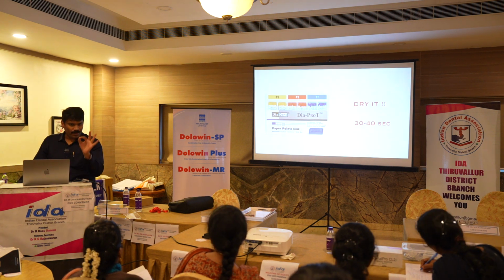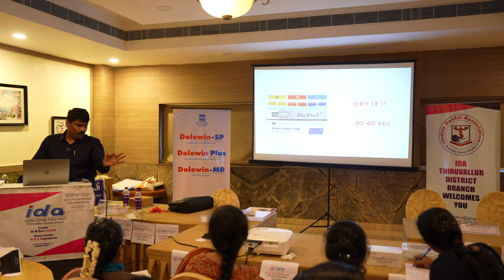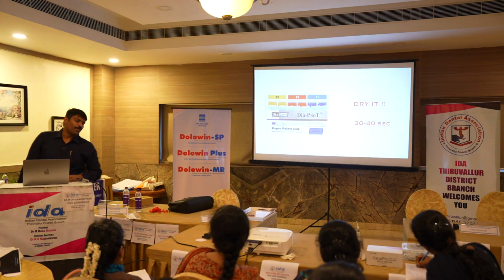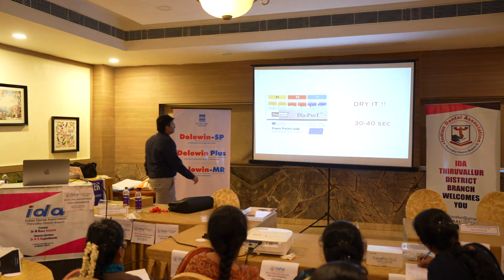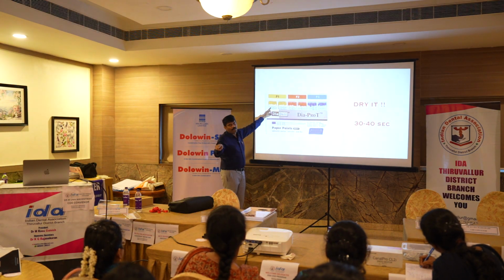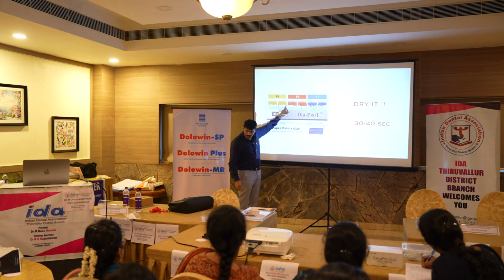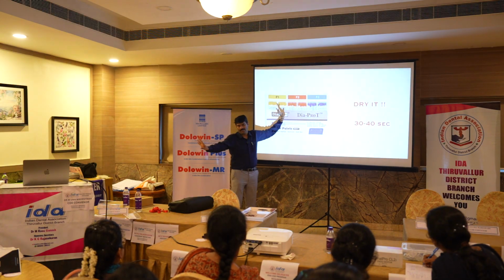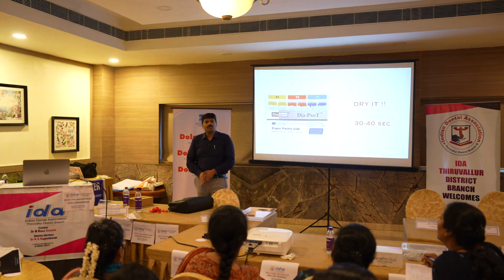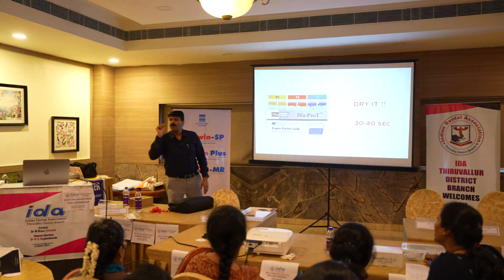When you place the paper point, I would advise you to buy the F1 and F2 if you're using a rotary file. Use the F1 paper point, place it inside the canal, wait for 30 to 40 seconds. If your paper point gets wet, it is absorbing. When you keep it inside and it is still remaining dry at the top region, which means the canal is dry. Dot. You understood? I keep a paper point, but my coronal aspect is not getting wet, means your canal is dry. Understood? Same for permanent.